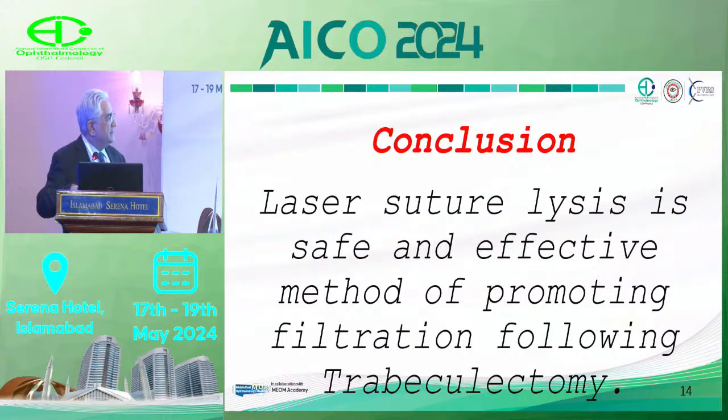So suture lysis is a safe and effective method of promoting filtration following any procedure of trabeculectomy. Thank you.